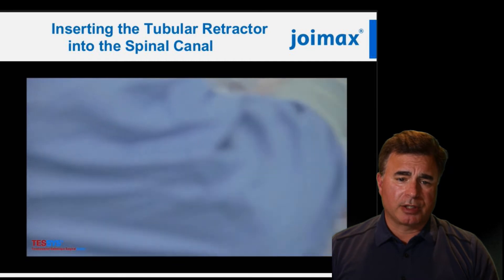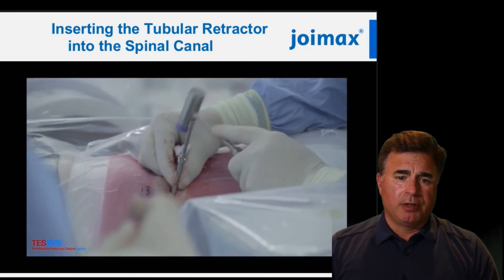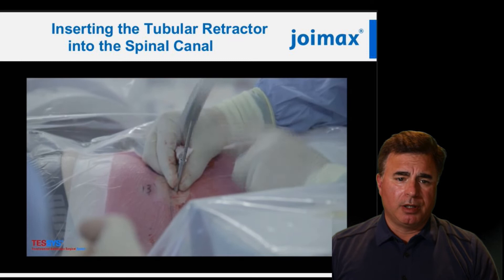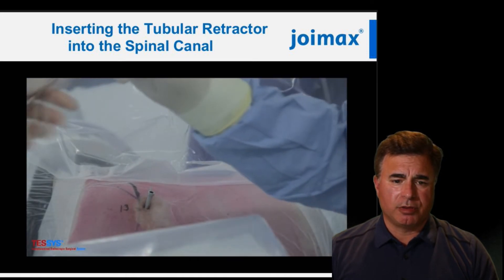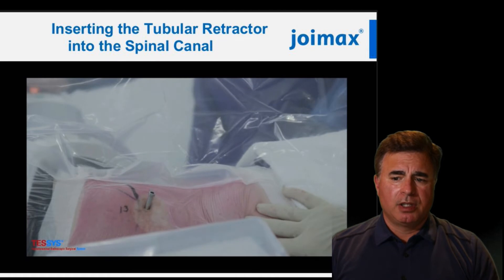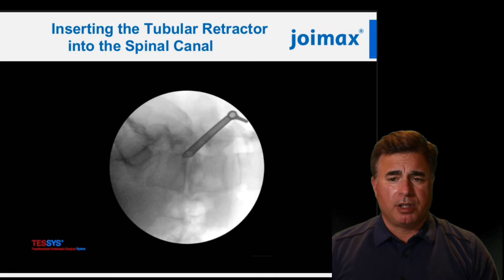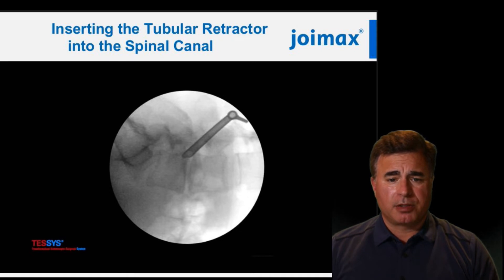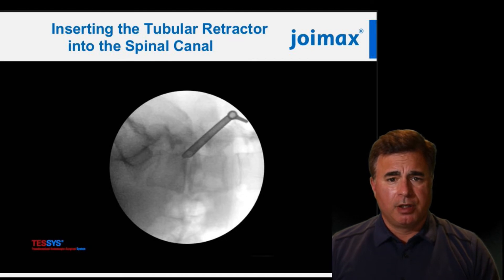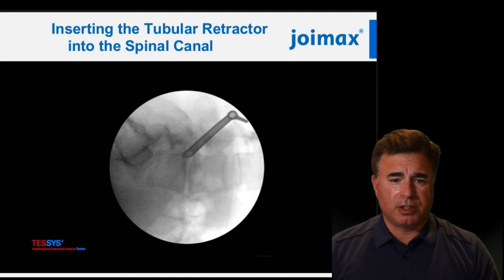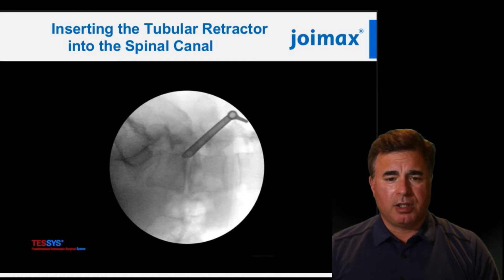The next step is inserting the tubular retractor. The tubular retractor is beveled, with the opening of the bevel in line with the handle that you use to insert it. Think of the long end of the bevel as a retractor — I insert it so that it goes underneath the dura and serves as a retractor. That way, when I get in with the endoscope, everything within the confines of the tubular retractor will be disk material and I can safely remove it. Notice on this lateral image that the opening of the bevel spans the entire disk space.